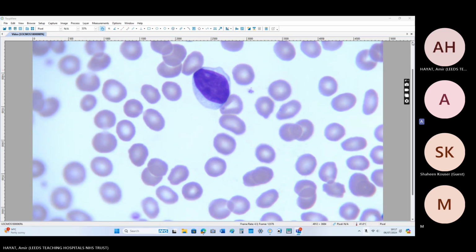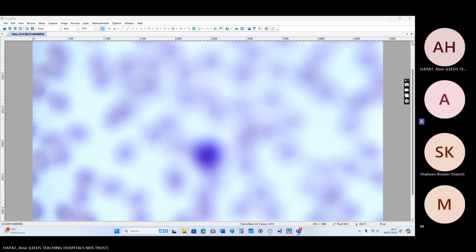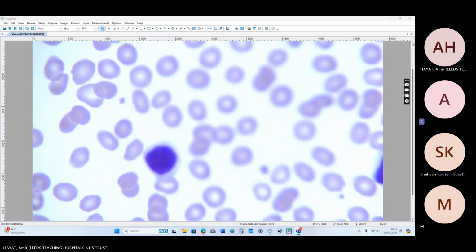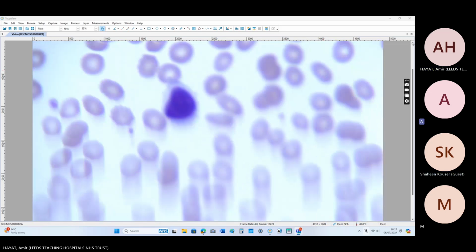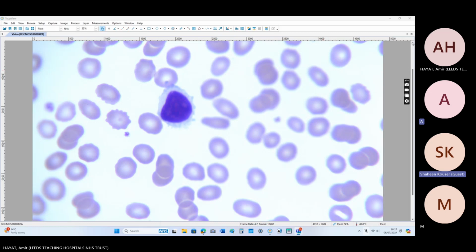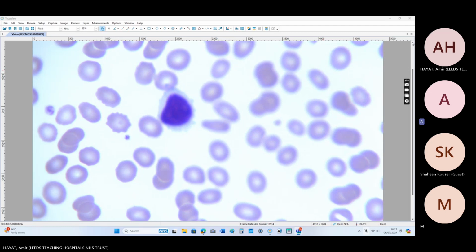But you just mentioned there is no spleen. Any rash or any autoimmune disease or anything? No, just lymph nodes and this. RBC morphology is unremarkable. However, I saw few elliptocytes. There is cytoplasmic projection, hair-like projections with prominent nucleoli.